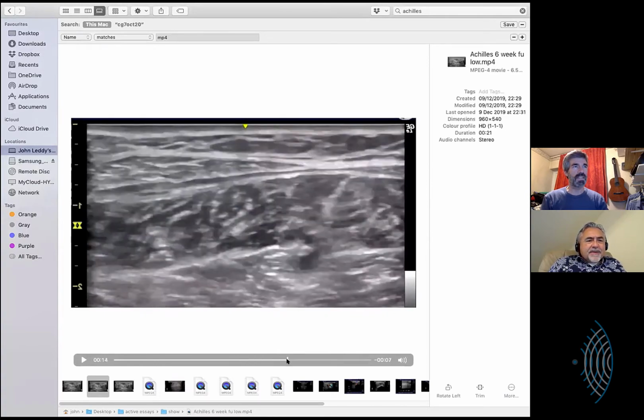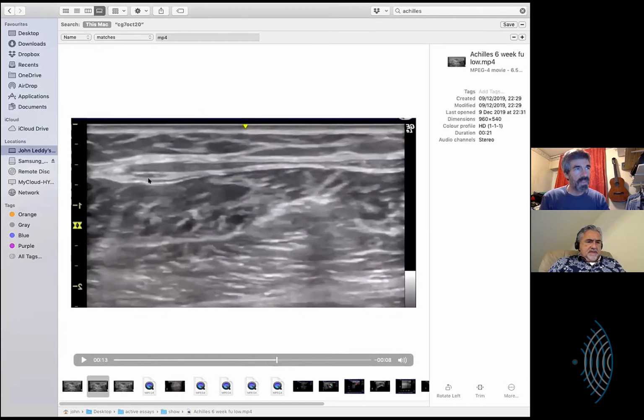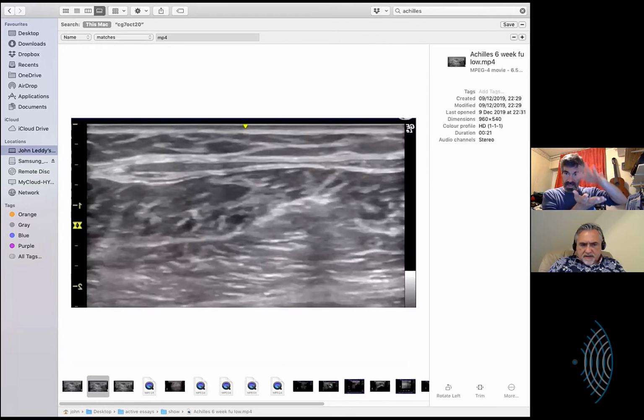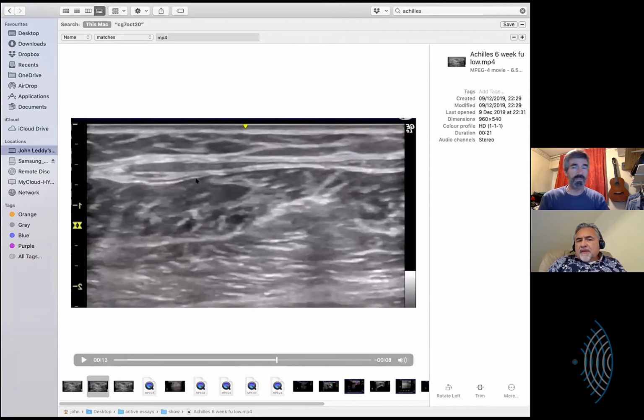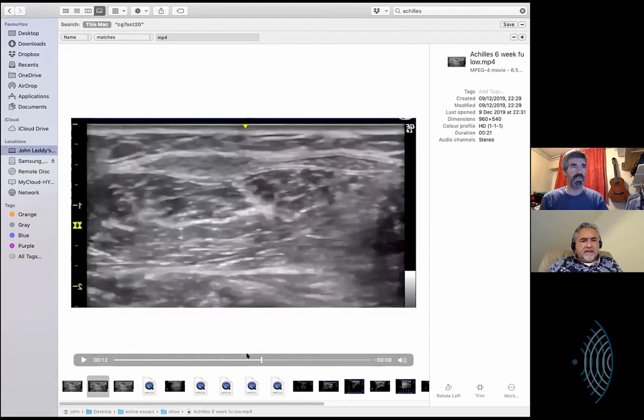As we come distally, I lose the quality of the scan at that point. So if I come back to there, this is normal. And this is soleus aponeurosis, which makes the superficial surface of soleus, and this is the gastrocs. All of that meat below that, is that soleus or flexor tendons? Well, this will be soleus and then probably flexor tendons underneath that. But if we follow the soleus back in, you'll be able to tell. No, that's all soleus. It all comes together.